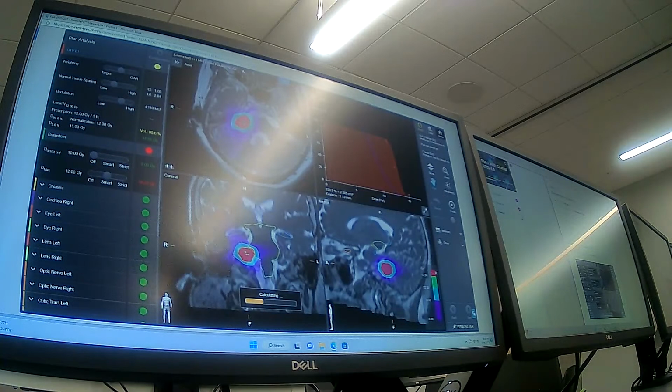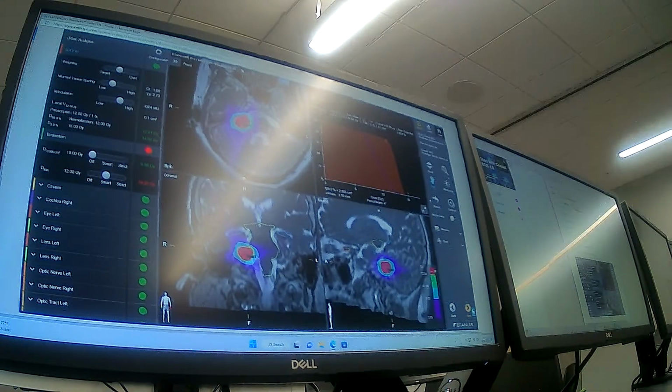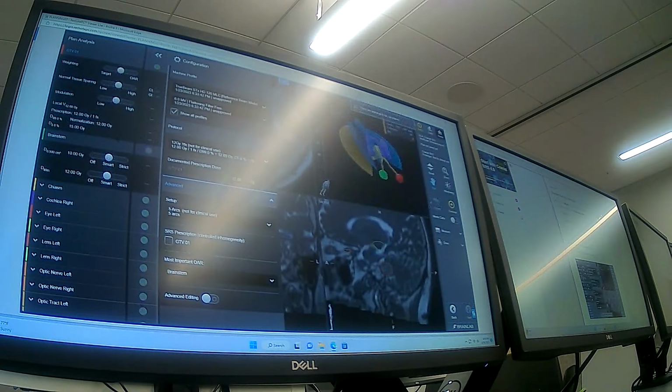So what do they usually go for? It's physician dependent. I've had some that don't care about hot spots and say keep going, and I have some that will sacrifice tumor in order to reduce that. So it really is physician dependent. And that's why when you go in anywhere, you have to learn what the physician wants, how they do it, what they're interested in.